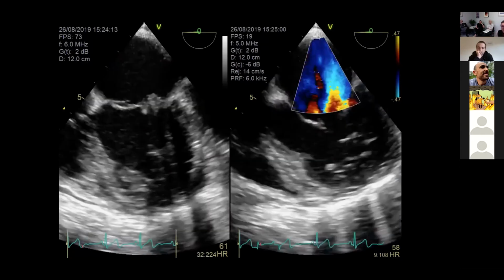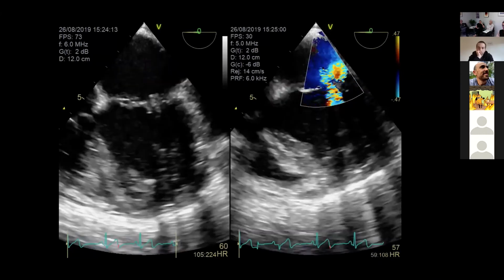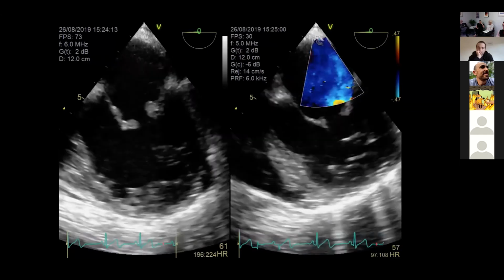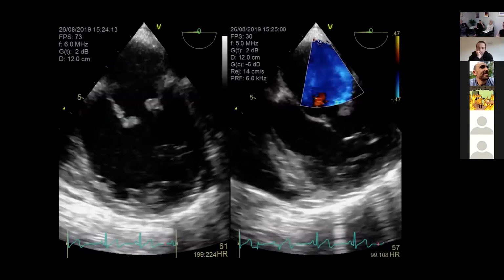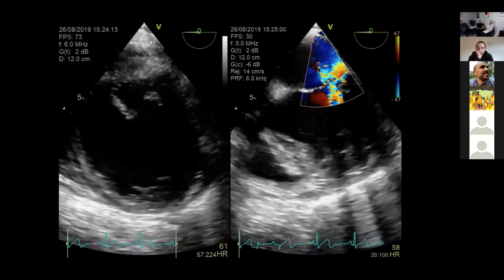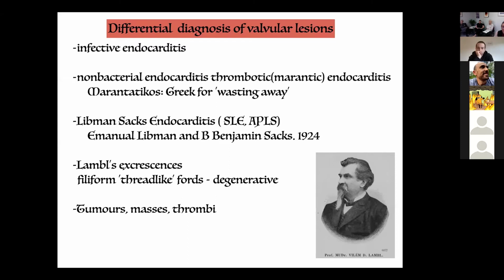If you were thinking, I mean, we see quite a bit of infective endocarditis. Looking at those, they did not look infectious to me, but I still believe it was endocarditis. They're homogeneous. They don't seem to have a stalk. They seem to be attached to both the anterior and the posterior mitral leaflet. So let's carry on, because whoever spoke last hit it on the head.